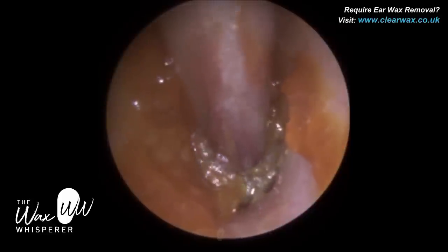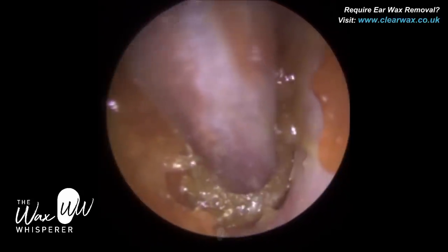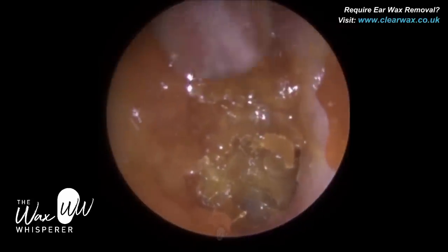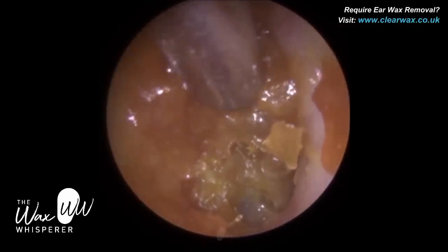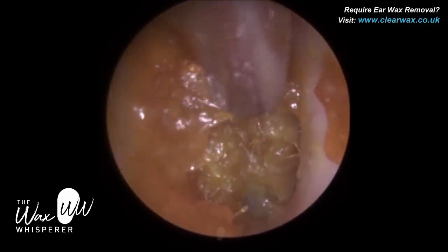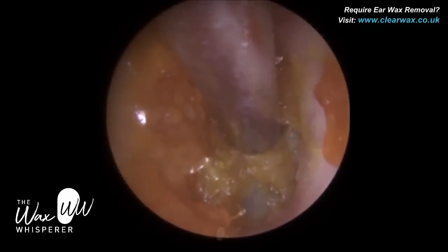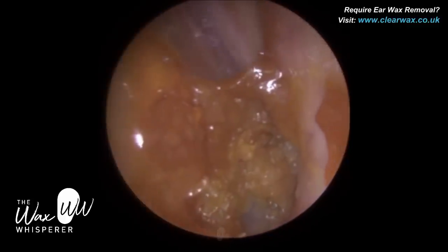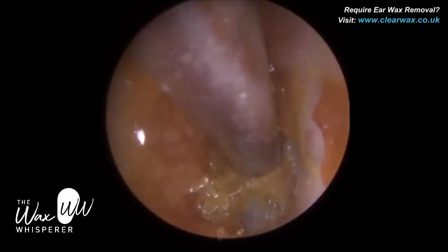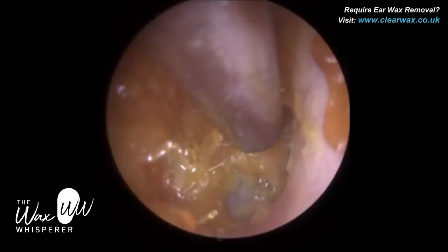The distal end — the far end of the ear funnel — can range between 4mm and 6mm on average, so you're already narrowing the available space in the ear. With an endoscope, there's no speculum. One of the benefits of a speculum, actually, is to straighten the ear canal. The ear canal has two bends, and the outer third is made up of cartilage, so it's semi-flexible. A speculum can be inserted into the ear to stretch and straighten the ear canal.